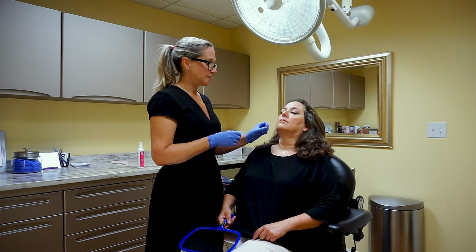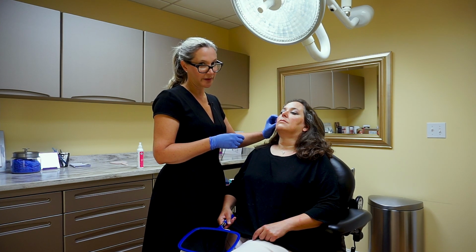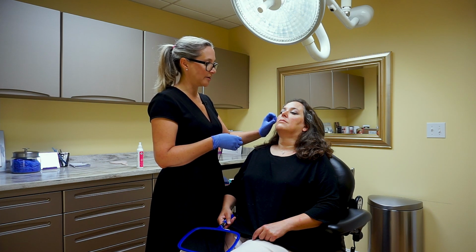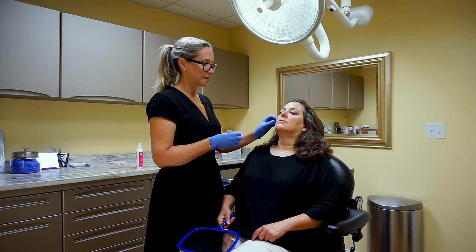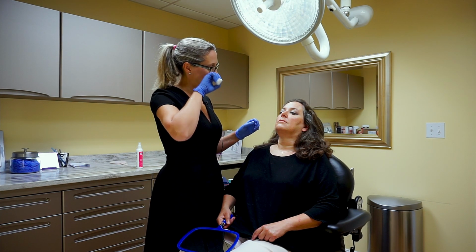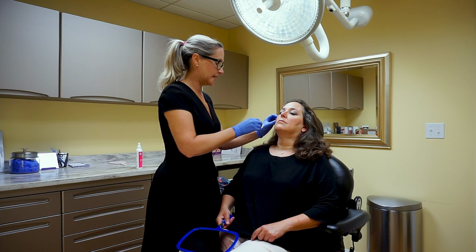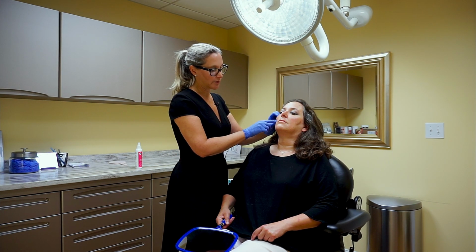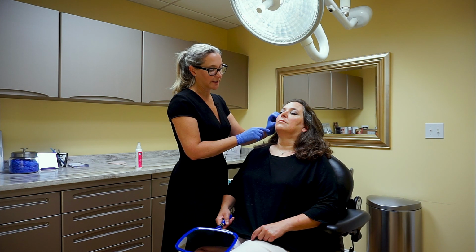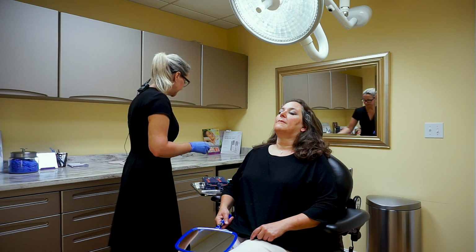What happens as you get older is that the fat pockets in your face start to descend, and that's a positional thing that could be changed with surgery, but the fat also starts to atrophy in your face. Replacing that volume can really restore a youthful balance to your face. Jody doesn't have a huge amount of volume loss in the face, but a little bit out here. When we put volume in, not only will it restore the volume that's lost, but it'll also give a little bit of lift. So you'll see some positional changes when you put the filler.